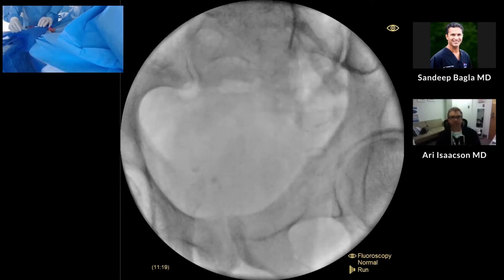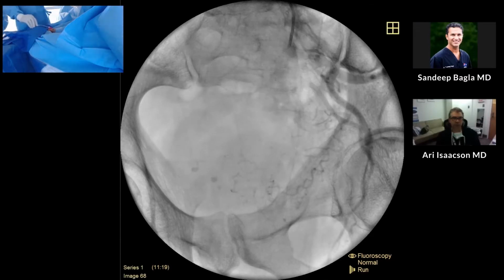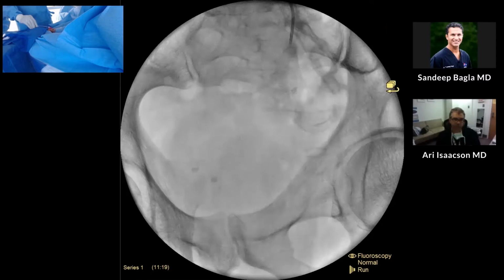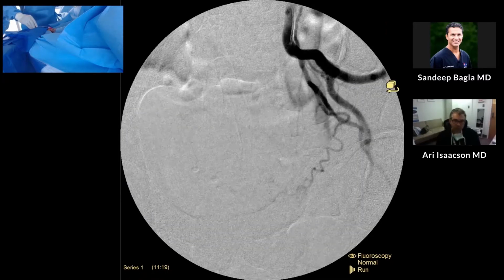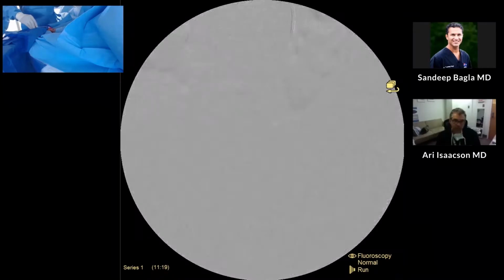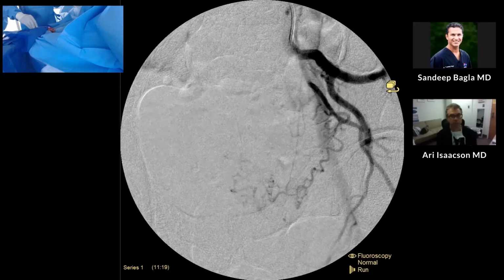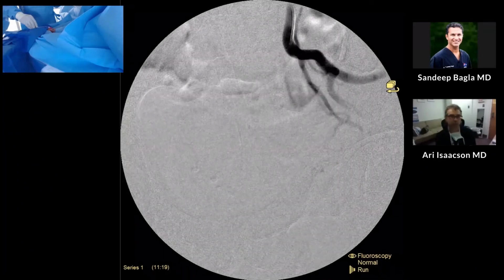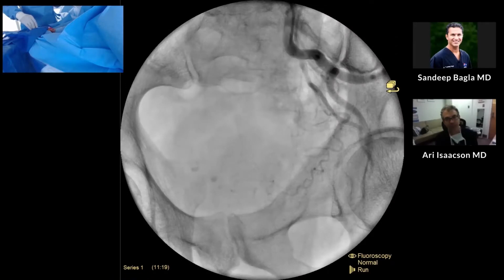So in this patient, we decided because he's 5'6", no cardiac risk factors, no history of a coronary stent, for example, in the past. So this was an ideal patient, with low risk of even having potential, say, for stroke. But definitely height was a consideration. For us, height is obviously an issue. Patients who are 5'10" and under, those are the patients we typically will offer radial access to.